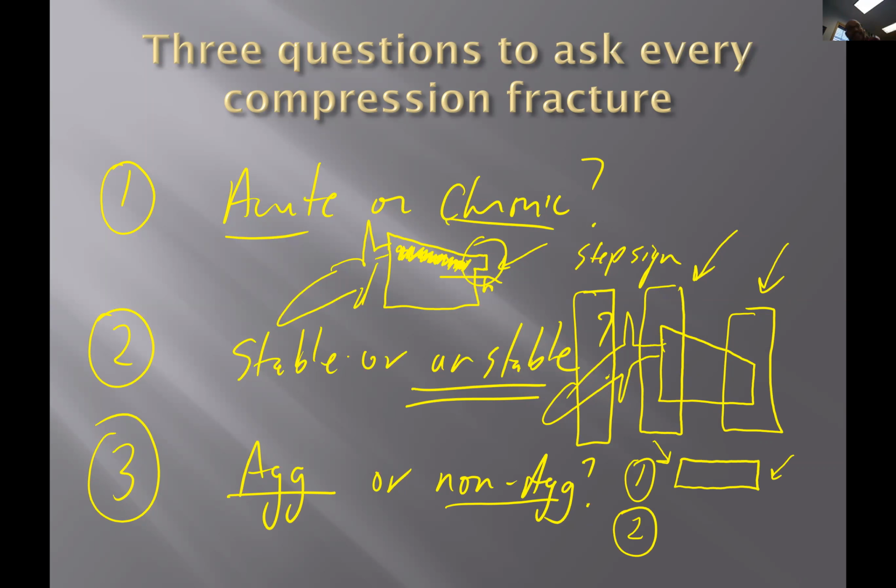I mean, you at least have osteoporosis that's superimposed, that's causing a compression fracture. And again, it's not a normal compression fracture. You've got an underlying condition that it's predisposed. But if you get loss of both anterior and posterior, I think you got to get an MRI, because metastatic disease and myeloma can look like that, and you just don't want to miss it. So I think that's indication of more aggressive if you see loss of both anterior and posterior vertebral body height.